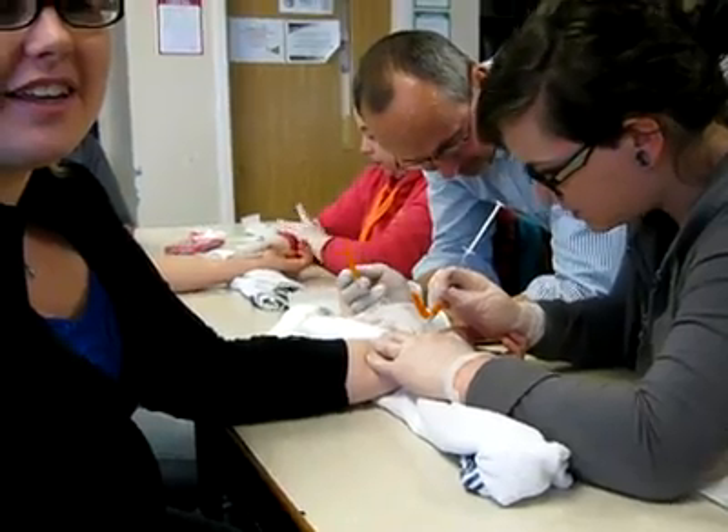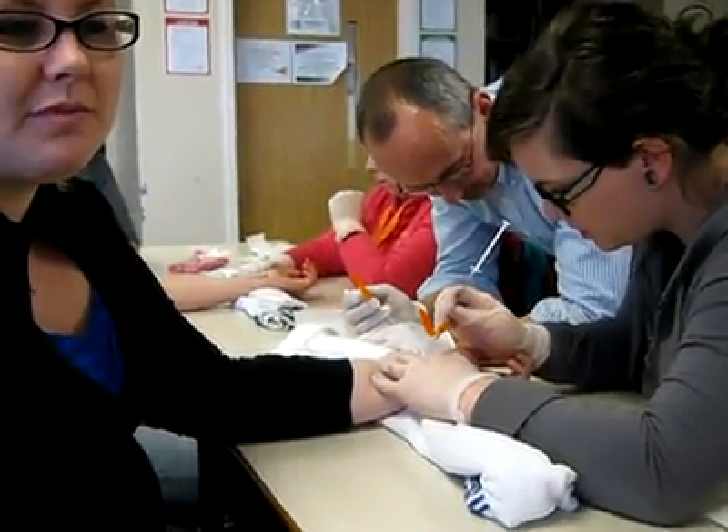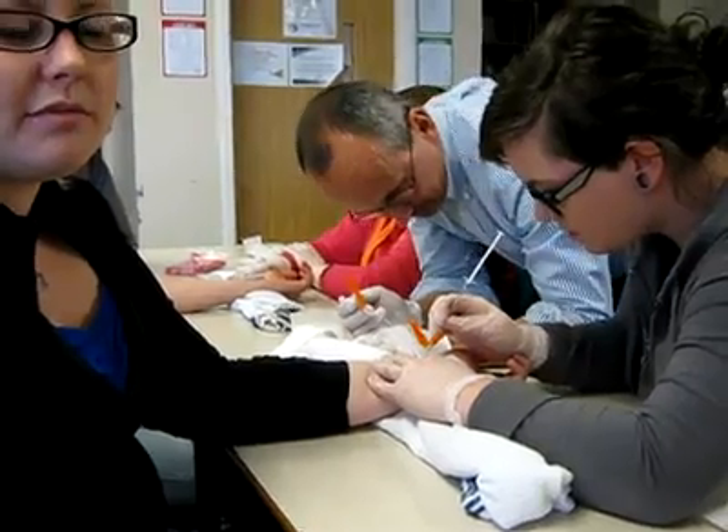Talk to your patient. When you say big breath in, that's when you puncture the skin. Deep breath in. And puncture the skin. Straight forward.